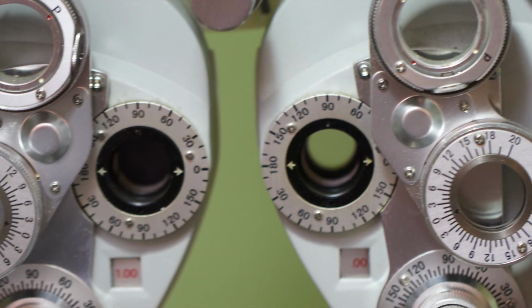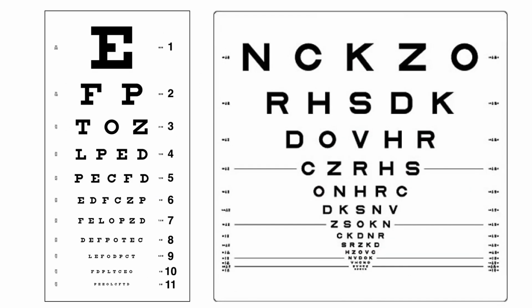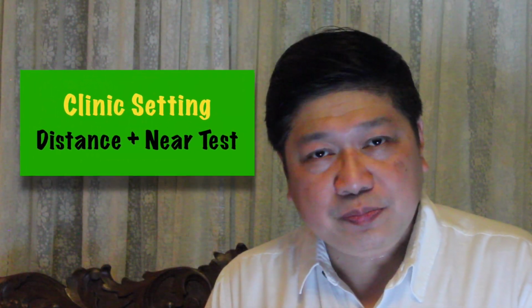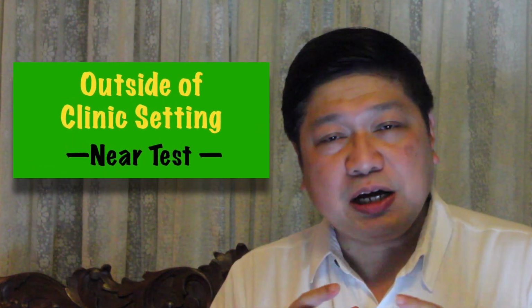Since it is so important, there are a lot of options available to check the visual acuity, from the modern LED screens, chart projectors, to different types of cardboard posters. But let us start with the most basic. In a clinic setting, we use a distance vision chart and a near chart. But outside of a clinical setting, we can use a near chart. But the principles will usually be the same.